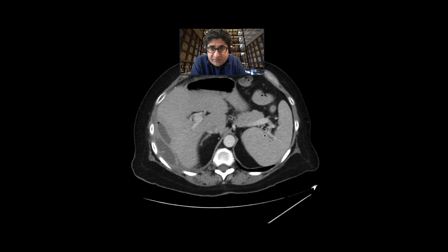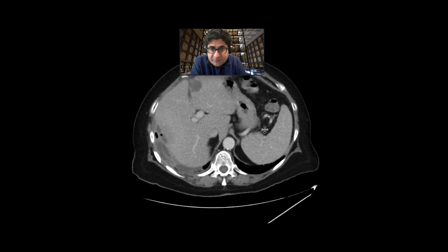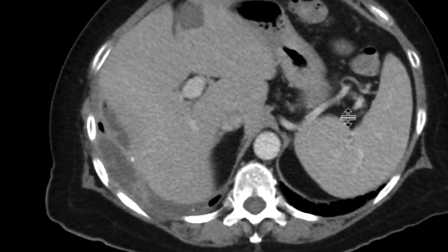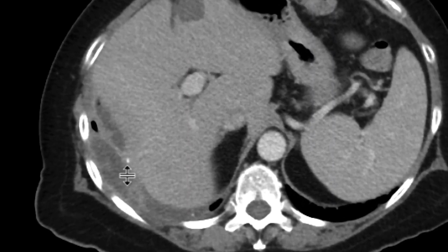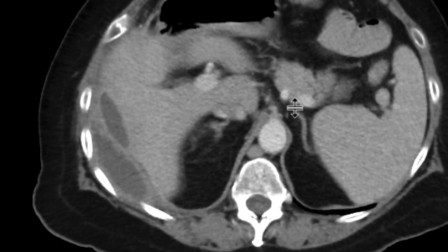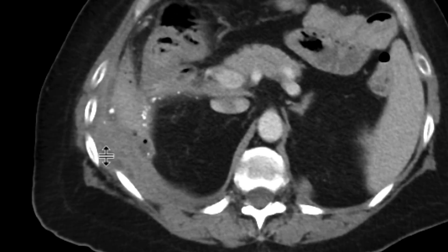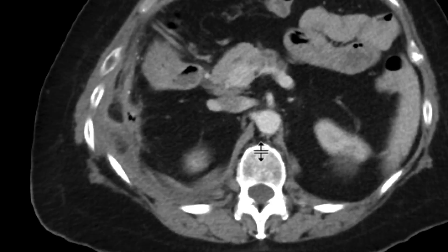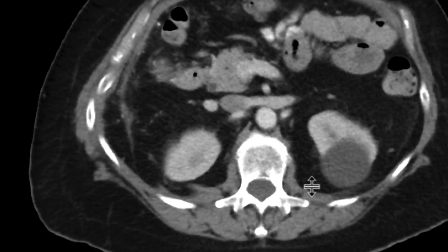What's causing these abscesses? Difficult to say at first, but then you start to notice that there's a little tiny calcification associated with one of these collections adjacent to the liver. You scroll more inferiorly, there are numerous calcifications that are lining portions of that inferior aspect of the liver.